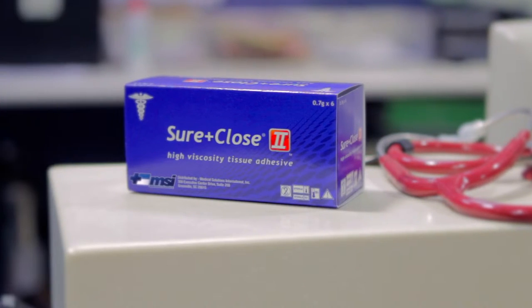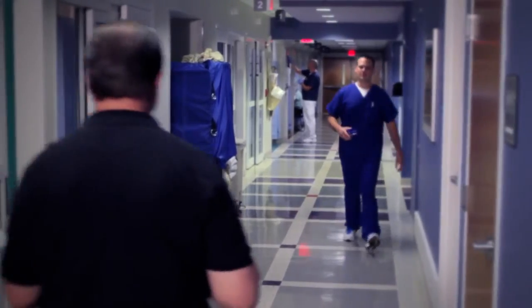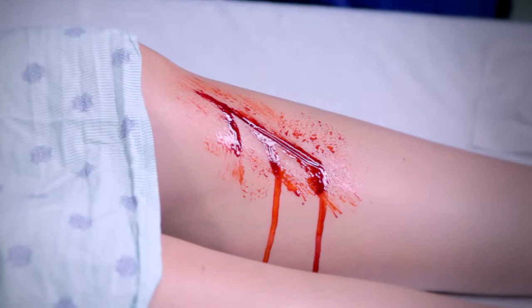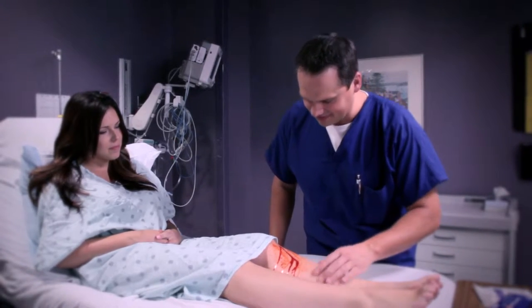Sure Close 2 is a sterile, high viscosity tissue adhesive designed to deliver a strong and flexible wound closure for a wide range of surgical procedures. It promotes safe and effective healing, and it's easy to apply.